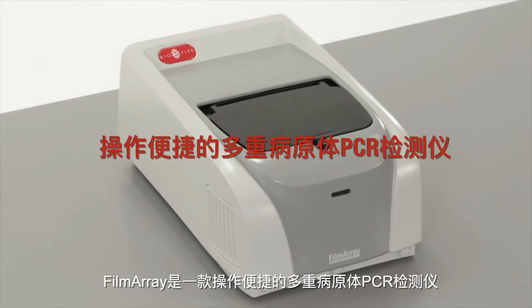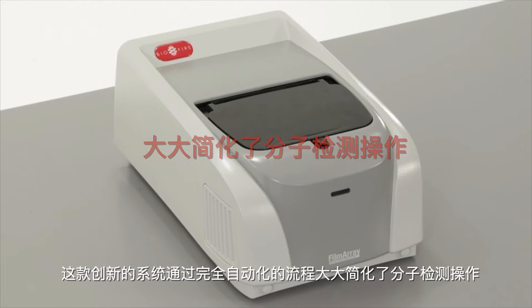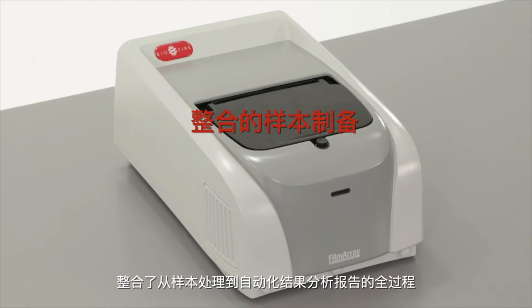The FilmArray is user-friendly multiplex PCR. This innovative system simplifies molecular testing through a completely automated protocol, beginning with integrated sample preparation and ending with automated analysis of results.